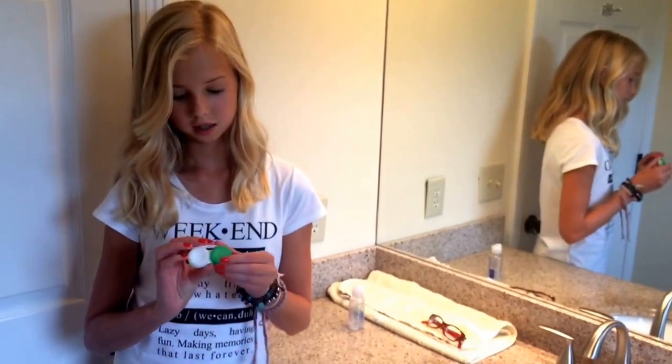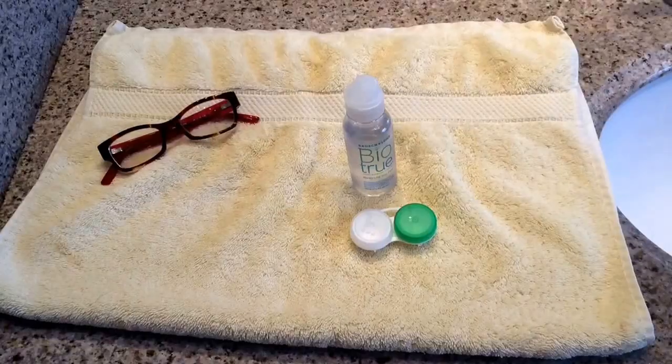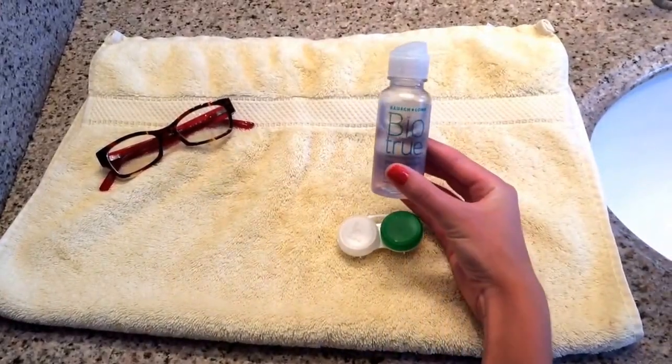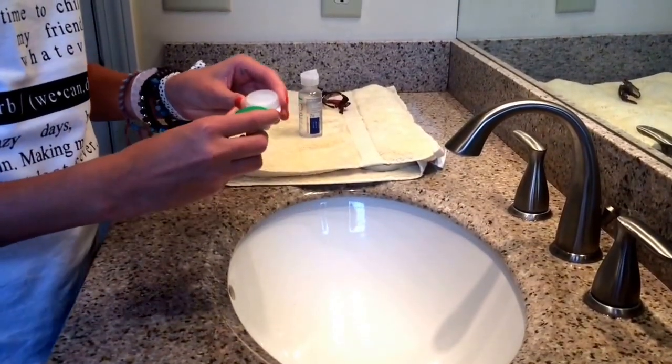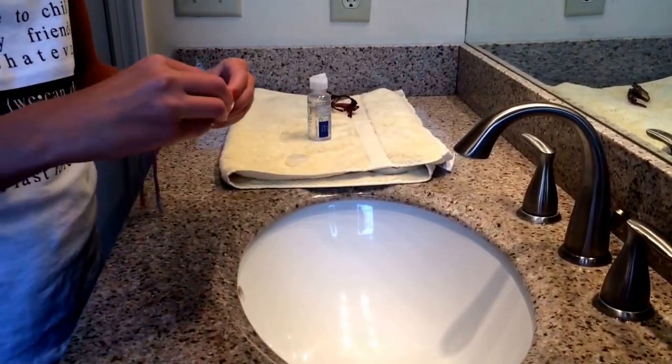The contacts I wear are weekly, so I have to keep them in a case and take my contacts out every night. What you're going to need is a contact case and contact solution. You want to make sure your contact case is clean, so take the caps off and rinse it out before you put your contacts in.